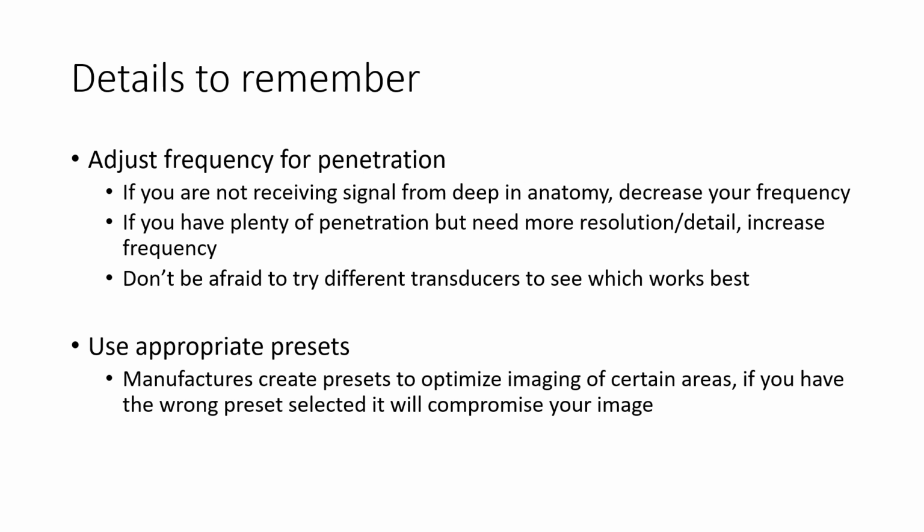You also want to use appropriate presets. Your manufacturer of whatever equipment that you have will have appropriate presets such as abdomen, vascular, GYN, things like that you would select off your computer screen. Lots of times we're so anxious to get scanning, we turn it on, we grab the transducer, we start with whatever's been last selected. And with that, a lot of the settings will be off if we don't have the appropriate protocol selected. So it can save you a lot of time and frustration just to take that moment, select the appropriate preset, and get started with your scanning from there.